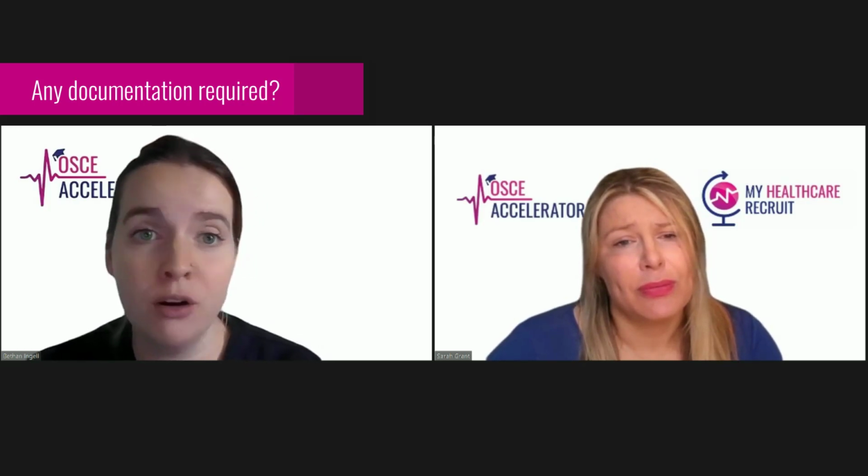Okay. And then you need to discuss with the patient if their reading's okay or if it's below average or above. If it's above the expected, that's really good. And if it's below, that's not very good. The way I would suggest to remember this is, let's say you've got a patient who does a lot of sport, they're young, like an athlete, they're going to find breathing into the tube really easy to do, aren't they? So we're going to get a high result. If you think about one of the patients we have on the ward who's probably very sick, they're short of breath, they're going to find it really hard to do. So they're going to get a lower result.